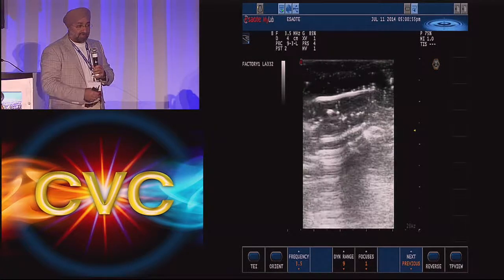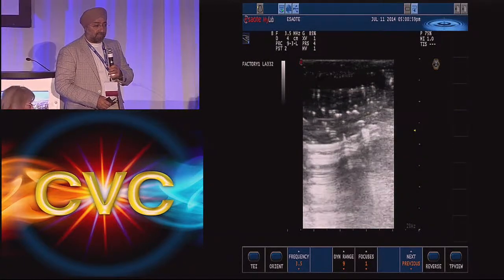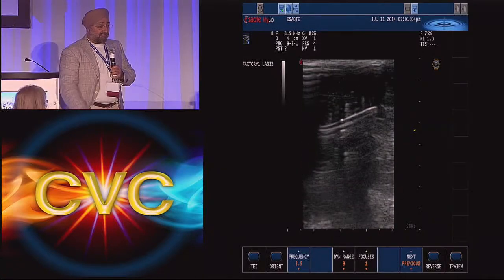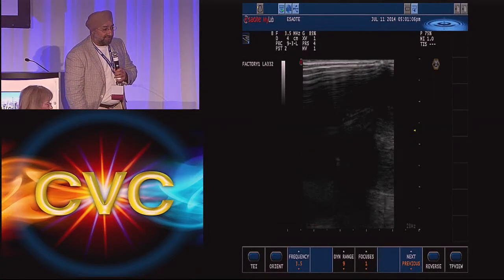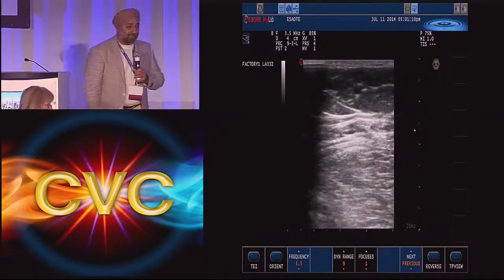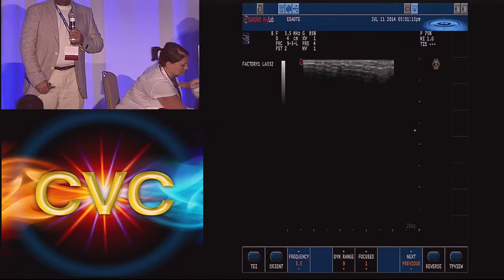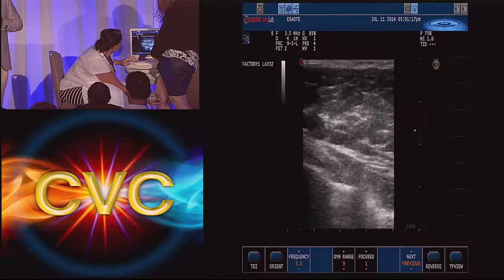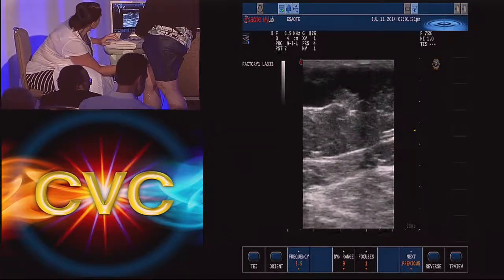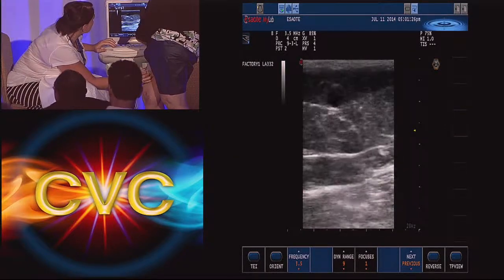And then, if you exclude the higher obstruction and there's GSV reflux, do you go on to ablate that? Abdominal varices will not happen from superficial venous disease, so there has to be something else going on. Symptomatic abdominal varices happen because they have a central venous obstruction, IVC or iliac obstruction. That's ruled out. It's already done, and there's no obstruction higher.